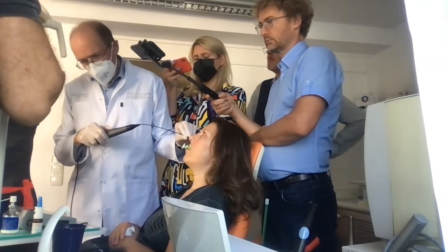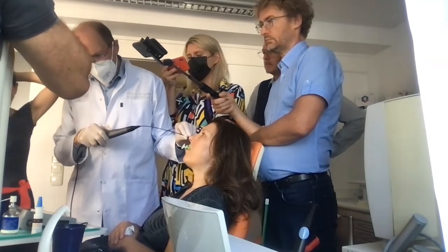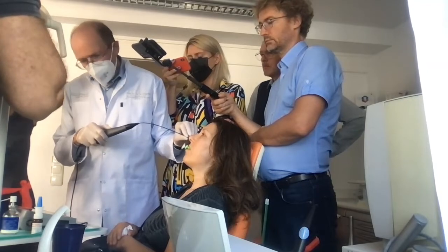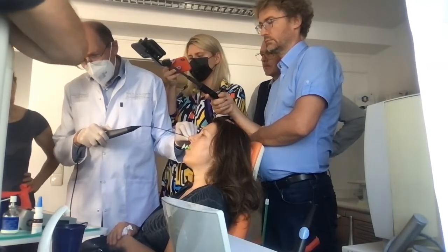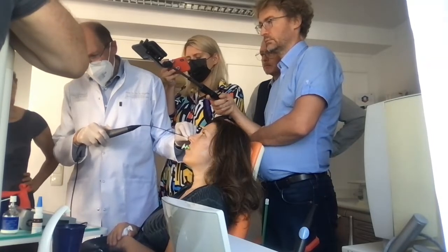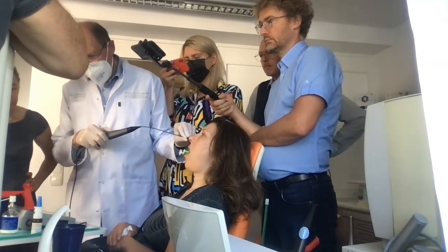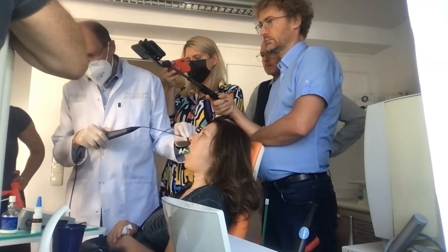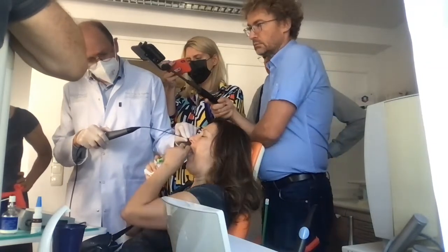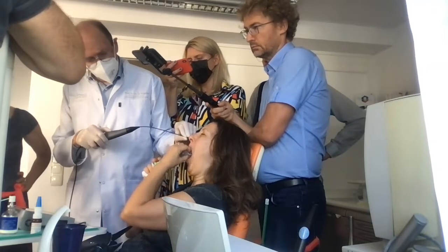Okay. With the splints on. Okay, try to snore again. Last one. And open. Please open your mouth. And clap your teeth. It's impossible. Okay, I know. And take it out, please.